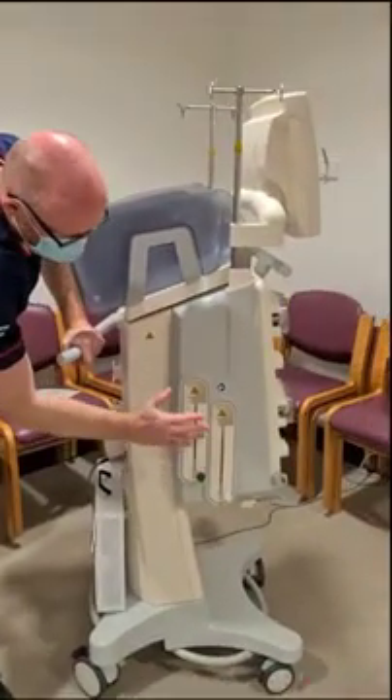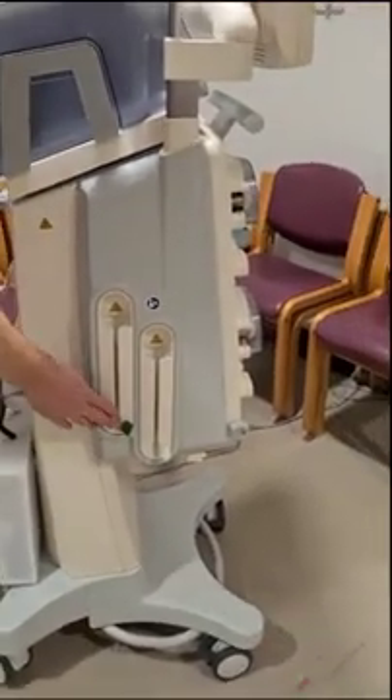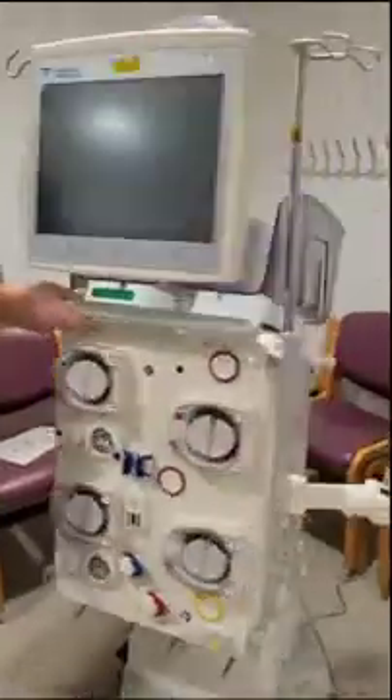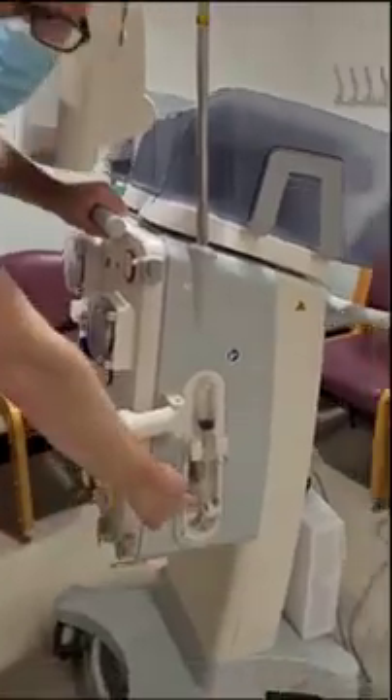Round the side here we have our heaters. We're only using one heater — we're using the green heater here, so we ignore the white heater. We also have our filter arm and our heparin syringe holder here.